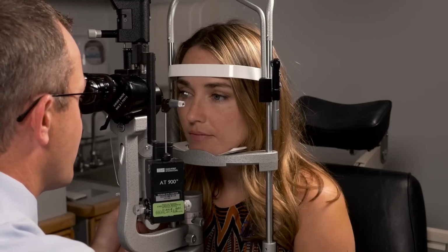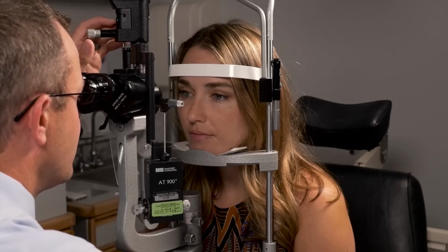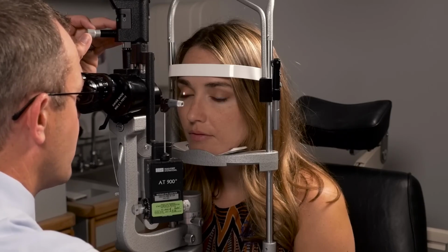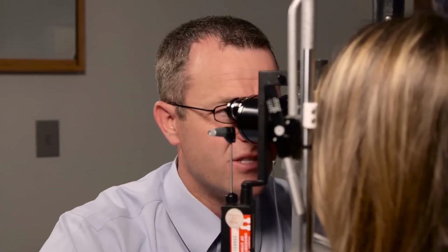And once you have the iris border or the pupillary border nice and focused, you can pull back a little bit. Also, you want to turn the beam up, and by focusing on the iris border and then pulling back just a little bit, that will allow you to see if there's any inflammation in the anterior chamber, and this patient doesn't have any inflammation in her anterior chamber.